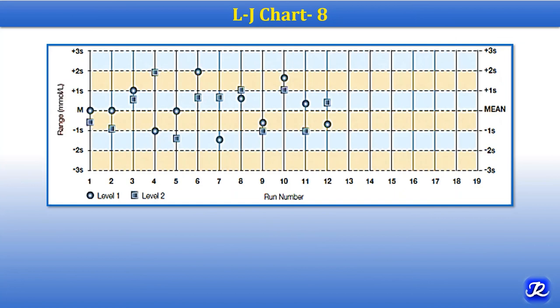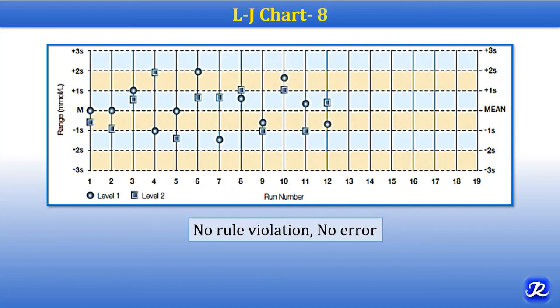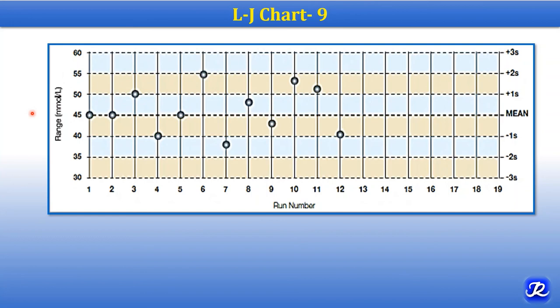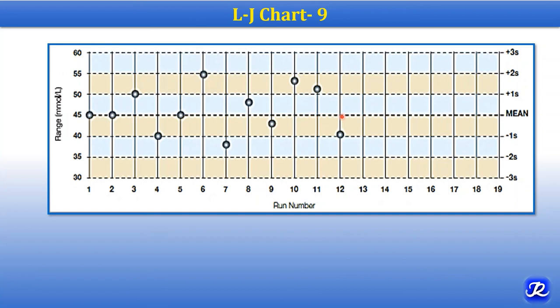In this LJ chart for two levels of control, there is no rule violation and no error. In LJ chart number 8, only one level of control is used. Looking at all the control measurements, there is no rule violation seen. You should write: no rule violation and no error.